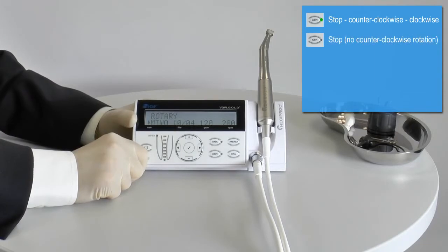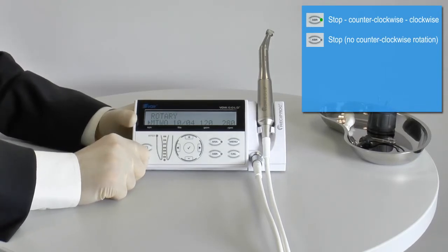When the ASR key lights red, the motor stops once the torque limit has been reached. However, the motor will not reverse in counter-clockwise direction.